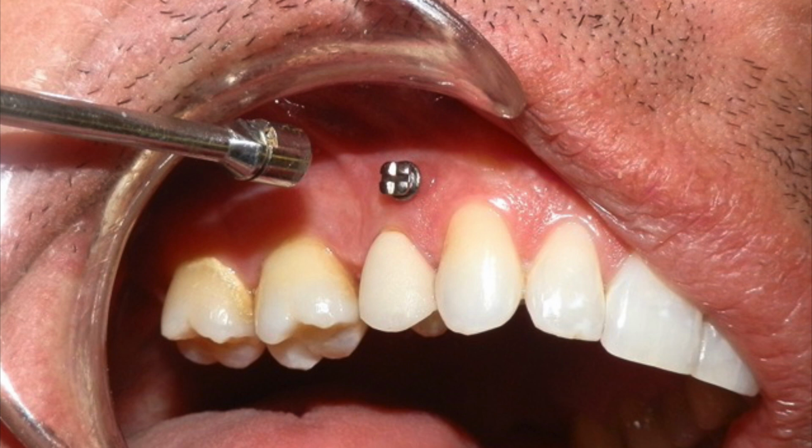back teeth forward to help fill in this extraction gap, because you don't want to retract all of the teeth backwards anymore with orthodontics, because in recent years they've learned that that closes off the airway and your tongue needs enough space to rest in your mouth comfortably on the roof of your mouth in order for you to breathe properly. So a T.A.D is going to help bring all of those teeth forward so that we don't have to just shove everything back. But right now, we're just using the elastics to correct the midline, and then with whatever is left in that space from the extraction gap, we're going to pull it forward.